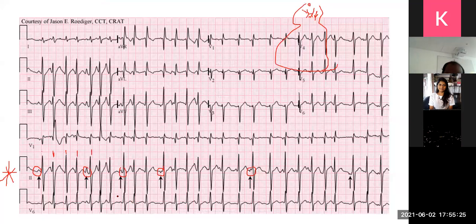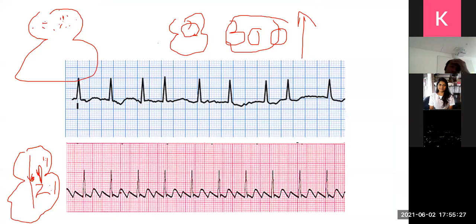Then, but you can see me. It is a first positive deflection. දැන් මෙතන තමයි T wave එක තියෙන්නේ. ඉතින් this is the T wave. First එක කියන්නේ negative වගේ deflection එකක් තියෙන්නේ. This is the P wave. This is a sawtooth P wave.